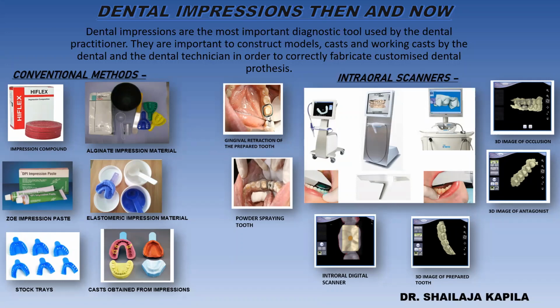The title of today's e-poster is Dental Impression, Then and Now. As we are aware, dental impressions are the most important diagnostic tool used by the dental practitioner. And this poster will compare the conventional methods with the intraoral digital scanning systems.